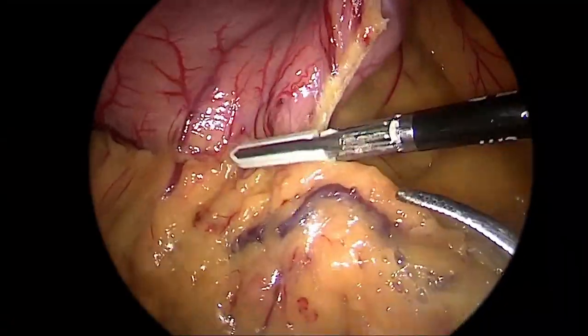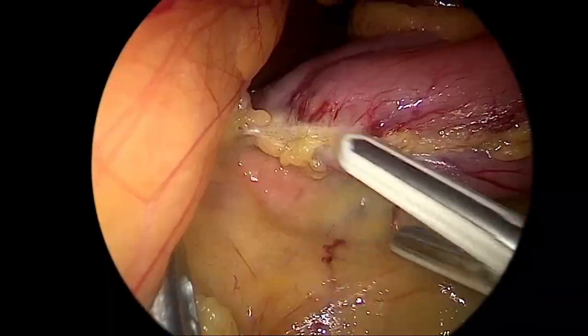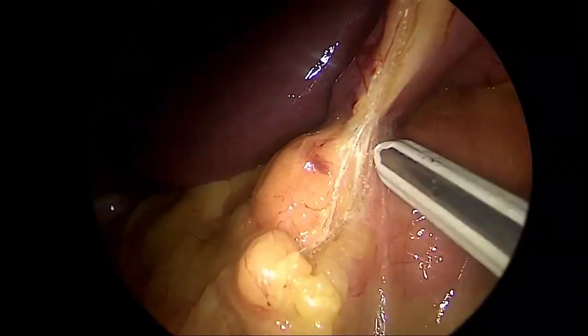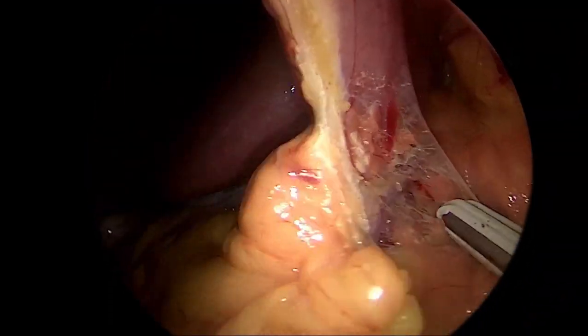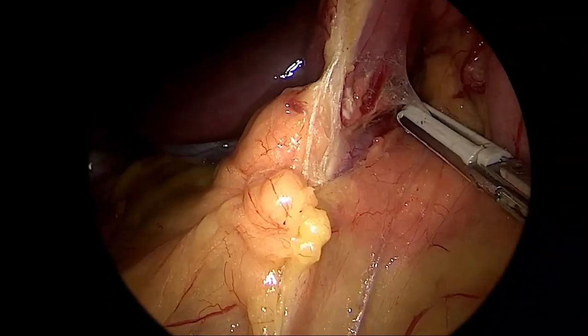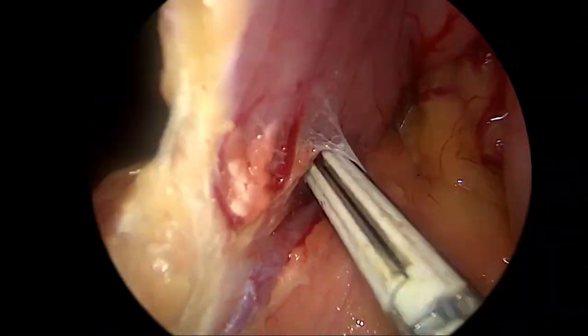Here I start dissection. I continue the dissection of the ordinary sleeve gastrectomy, dissect the greater curvature, and proceed downwards till the pylorus. Now I see the pancreas attached to the posterior aspect of the antrum, or of the first part of the duodenum. I push the gastroduodenal artery and pancreas down. Then I will see the gastroduodenal artery. The gastroduodenal artery is my main landmark.